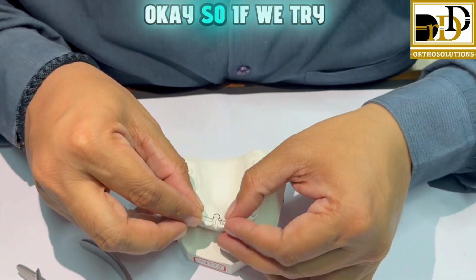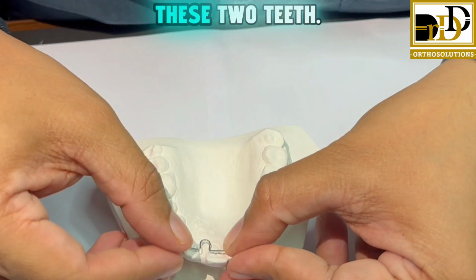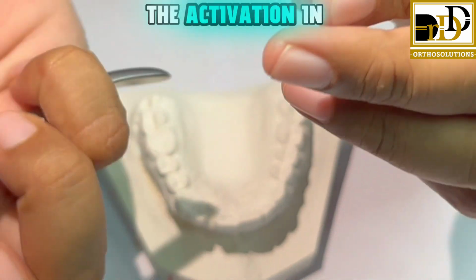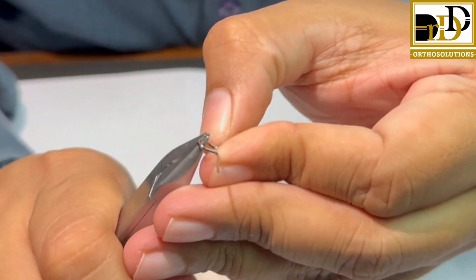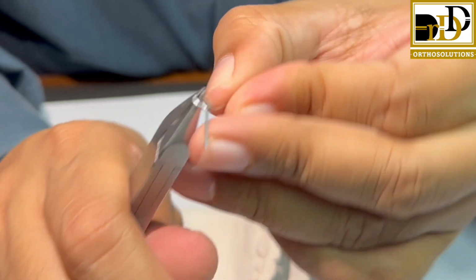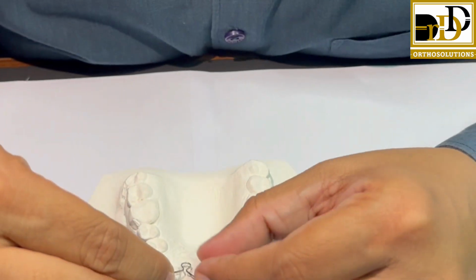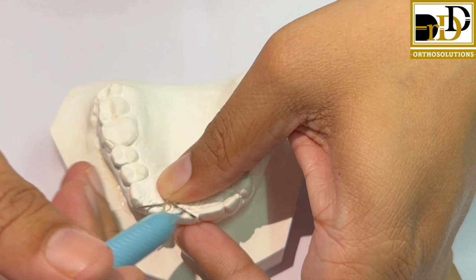Okay, so if we try to engage this wire between these two teeth, and if we try to close the loop by giving the activation in the loop, incorporating the activation in the loop, okay, it is going to get a tip which is going to become like a mesial tip.